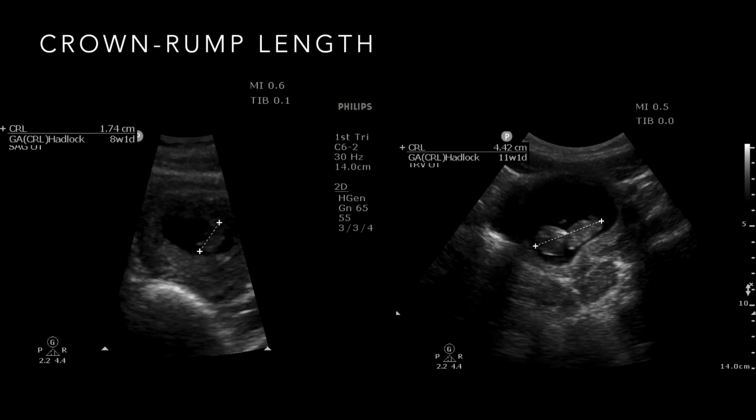And we do this all the time, right? All of our first trimester studies, we do a crown rump length, or at least all of them we should, at least if it's the first pregnancy scan that the patient's had, to estimate how far along that patient is, right?